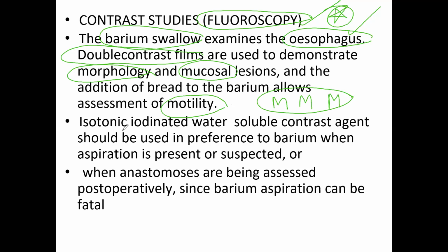And you should have isotonic, iodinated, water soluble contrast agent. It is always better than barium. Isotonic, iodinated, water soluble contrast is useful whenever aspiration is possible or suspected.